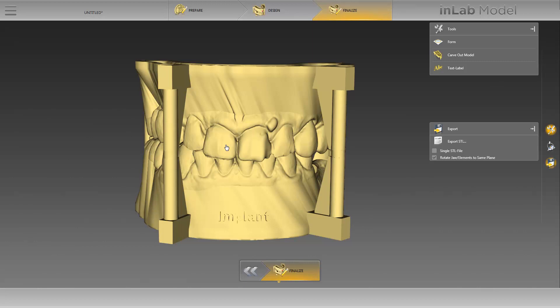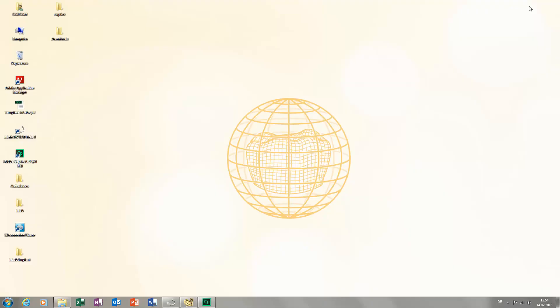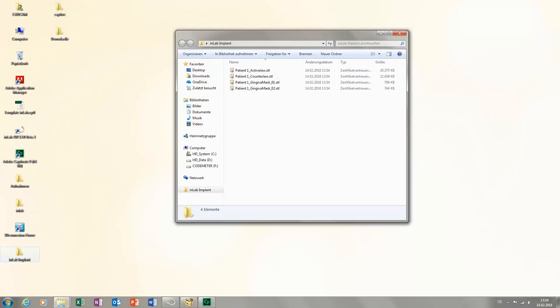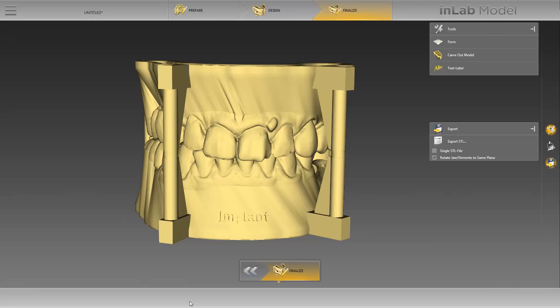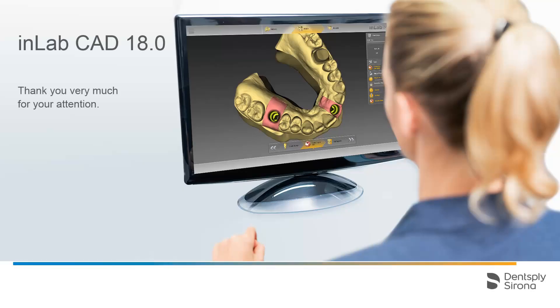Back in the model app, we minimize our window and check the saved data. The software has exported a total of four STL files for us: one file for the upper and one for the lower jaw, and one file for each gingiva mask. After successfully exporting the STL files, we can close the model app by moving the cursor to the top right-hand corner and clicking the X that appears. Thank you very much for your attention. We would like to wish you every success when working with InLab.